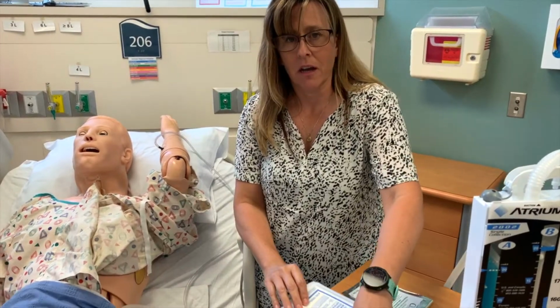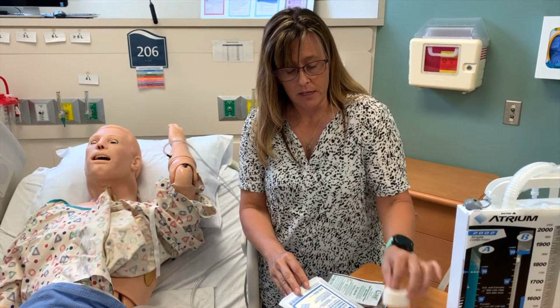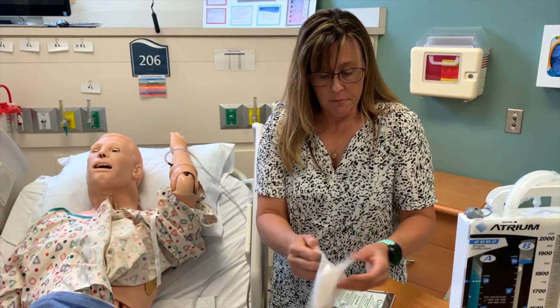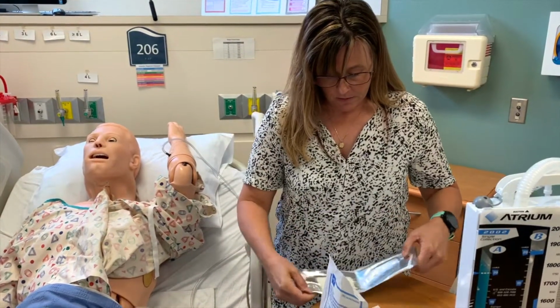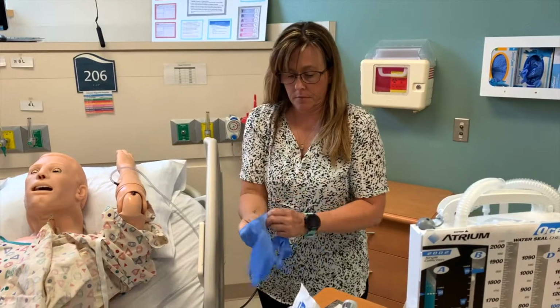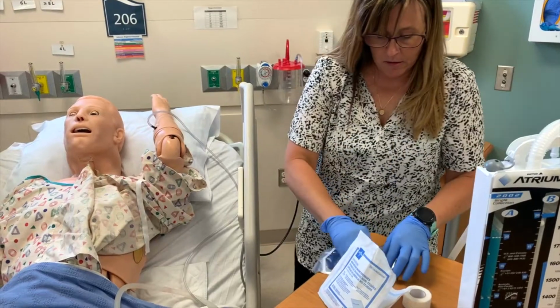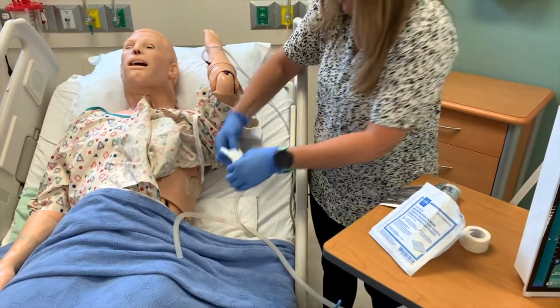I've got to get it covered as soon as possible. So always have this at the bedside. Have some 4x4 gauze, and then have a petroleum gauze, and then have some tape, all right? And what you'll do with the patient is you're going to put the petroleum gauze first over the site. You're going to put your petroleum gauze over the chest tube insertion site, all right? Got that there. And I'm going to get my 4x4 and put that over the top of that.